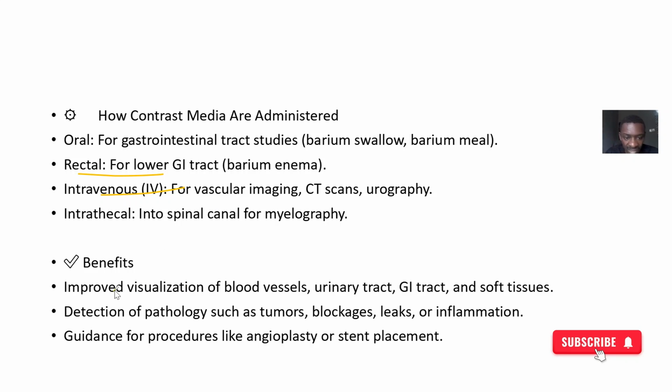So benefits, there's improved visualization of all those different parts of the body. You can be able to detect pathologies like all those tumors, blockages, leaks, inflammation. Okay. Then guidance for procedures like angioplasty, stent placement, the rest of it.